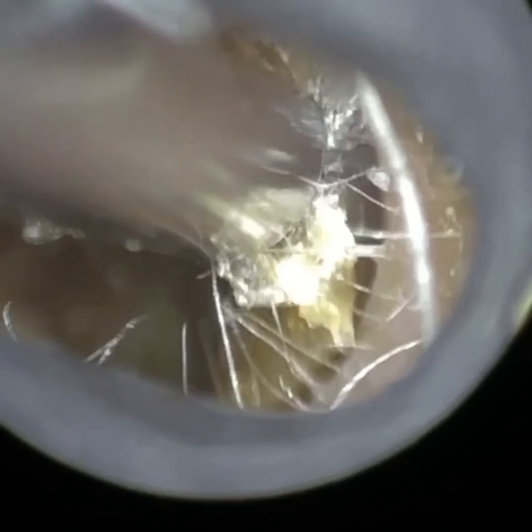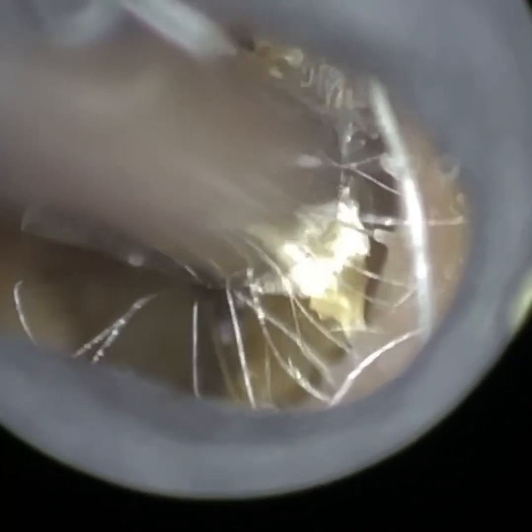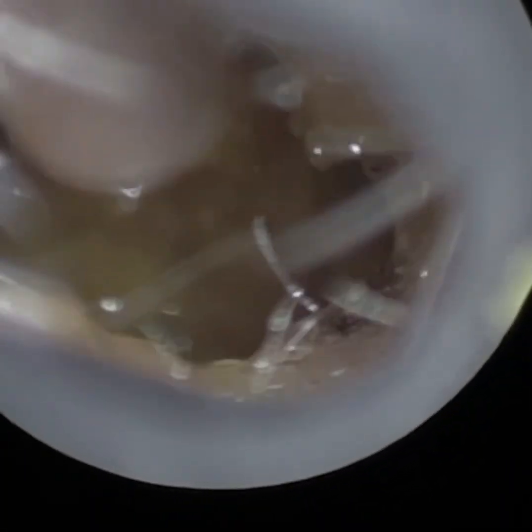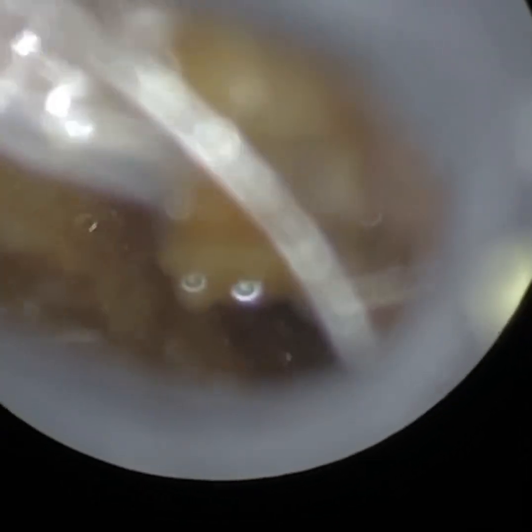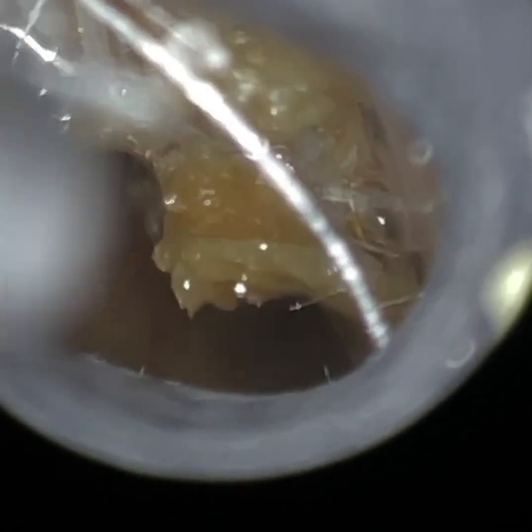As an audiologist and any healthcare professional trained to look inside the ear, we all should know how to use a speculum. That said, you're learning to use the speculum to straighten the ear canal past the second bend, because that's the crucial bit — some patients have a very bendy ear canal. So there is still a bit of a learning curve, but far less than with an endoscope.